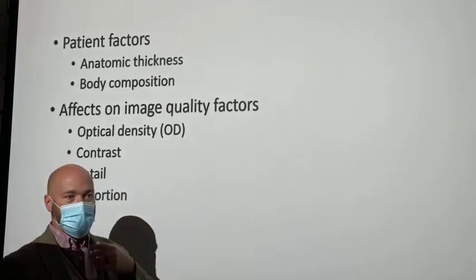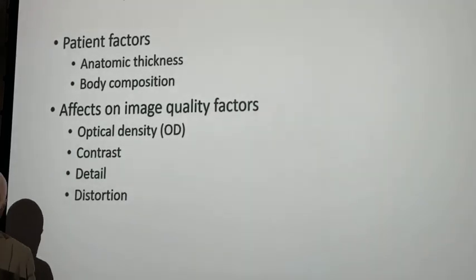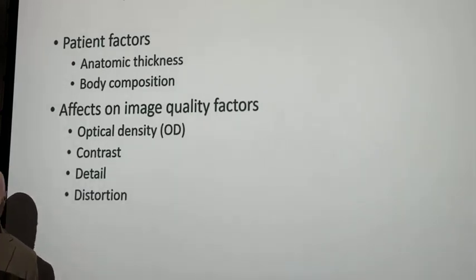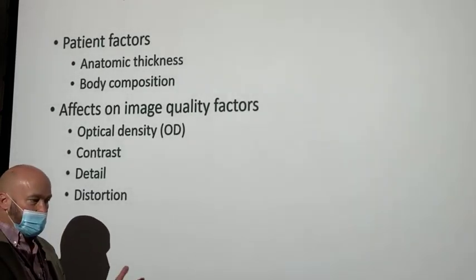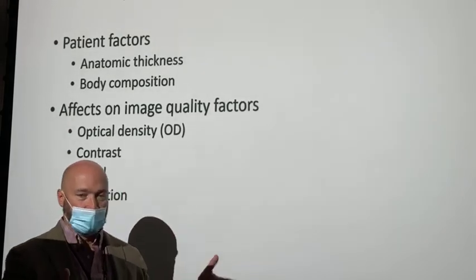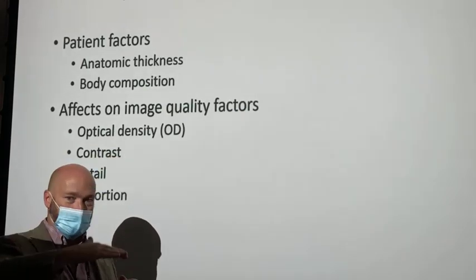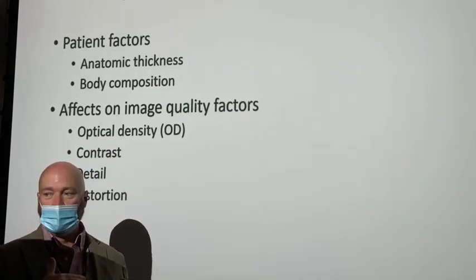And that's basically how your contrast and density is controlled on your image. I don't want to say regardless of what kind of technique you use, because it does matter, but if there are slight variances between what is an ideal technique and what you used, the computer corrects for it in that way. So it's a process that we call automatic rescaling, okay? So you make your exposure, if you've ever paid attention to the computer, and what you get immediately, as it's kind of loading, is this really great ugly image, right?